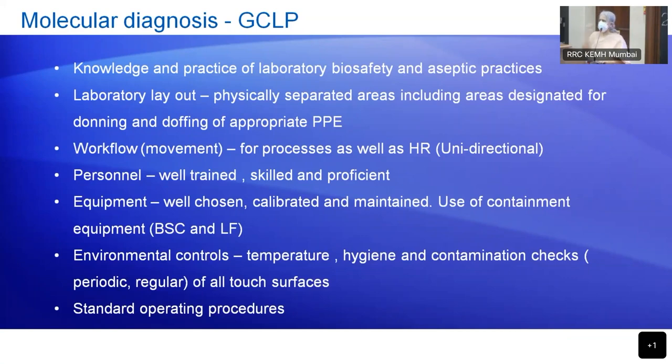It is not like you can go back and forth. It always has to be clean to dirty, one direction. Or you have two sets of designated staff: one who does the dirty kind of activity. Dirty doesn't mean garbage; technically it is the more contaminated activity that we do, and the other would do the clean kind of activity.